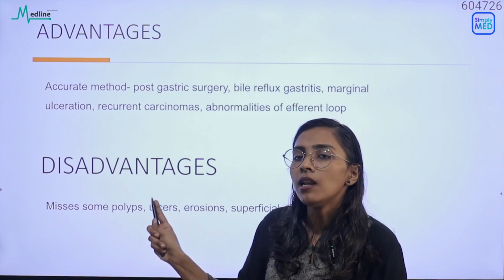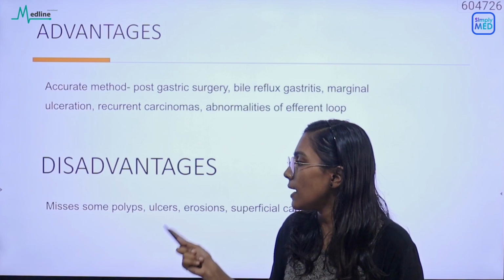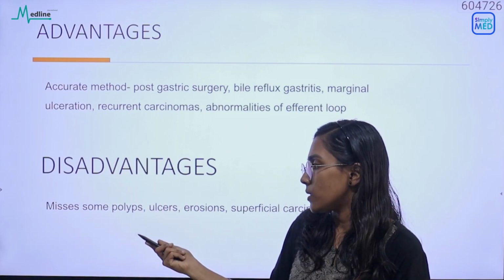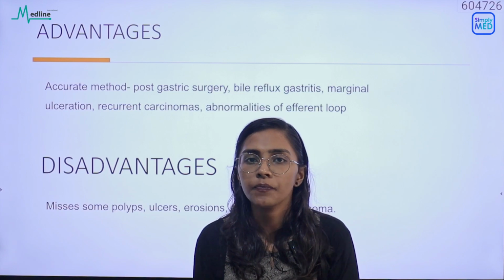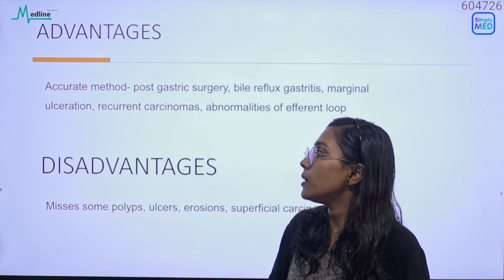Still, the double contrast barium study has some disadvantages. A double contrast barium meal can miss some polyps. It can also miss some ulcers, erosions, and superficial carcinomas. So these are the disadvantages of the double contrast barium meal study.